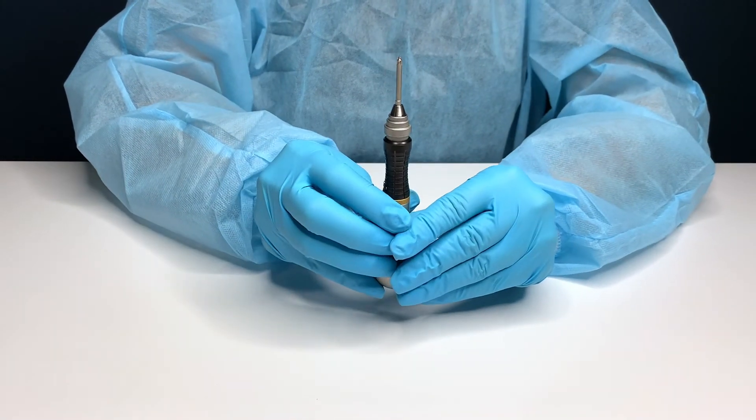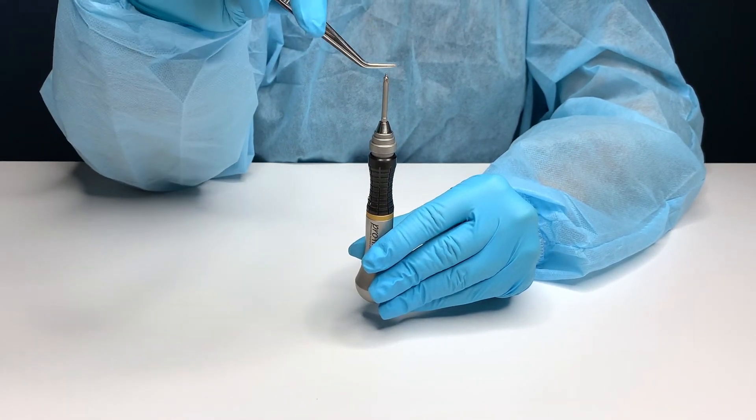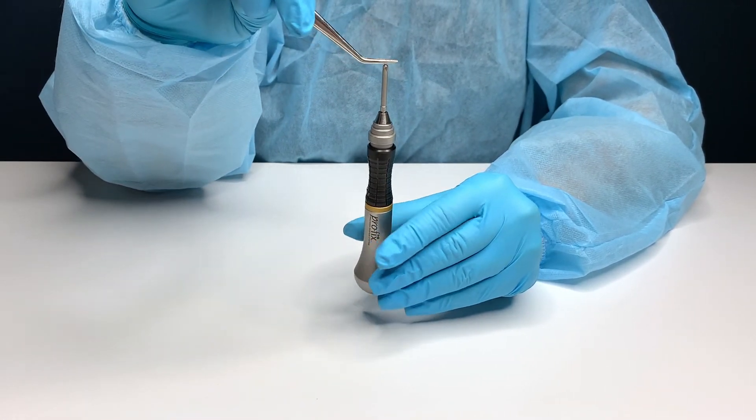The connection is so secure that you are able to hold the hand driver upside down while only holding the screw itself.